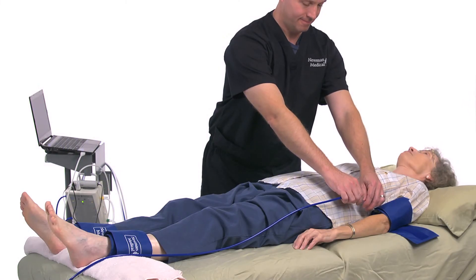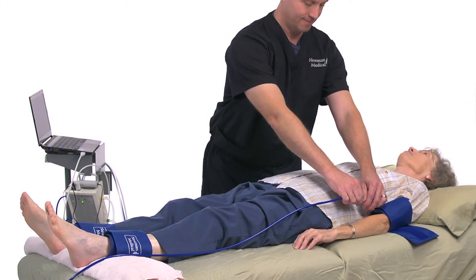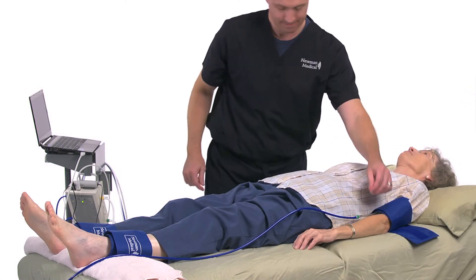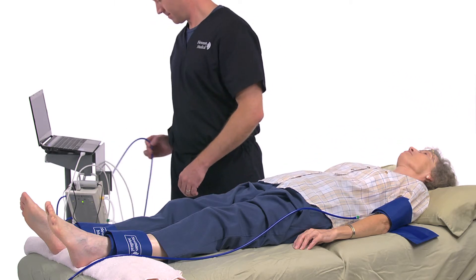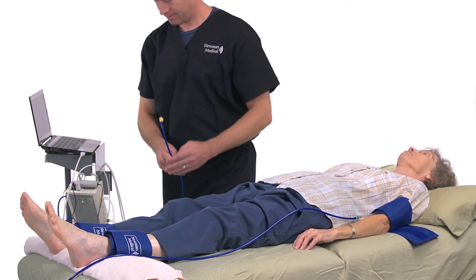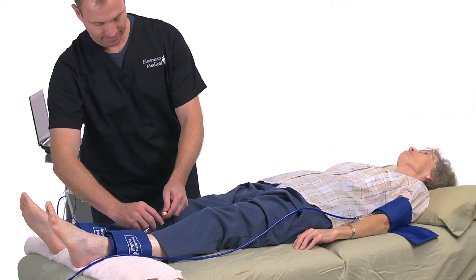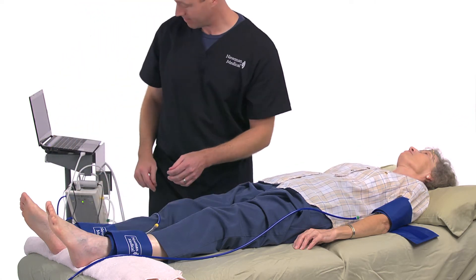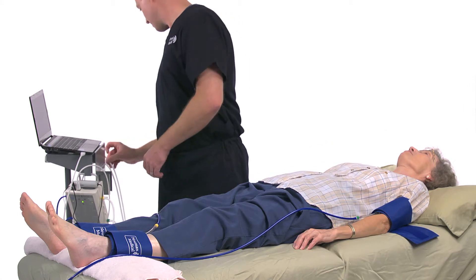Explain the test to the patient and inform them that they will walk for 5 minutes or until pain stops them from continuing. Request that they tell you the onset, location, and severity of pain, if any. Remind them to report any chest pain, shortness of breath, or severe fatigue.